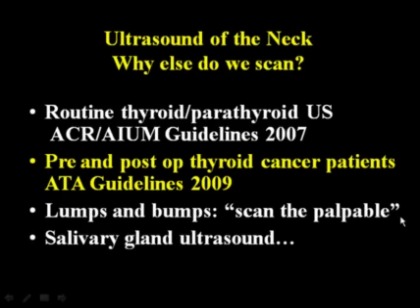Well, why else do we scan? First of all, the most recent revised American Thyroid Association guidelines from 2009 state that pre-op thyroid imaging of patients to look for nodal metastases in the jugular chain is important, and also a certain population of post-operative patients will undergo routine screening of the neck with thyroid ultrasound.